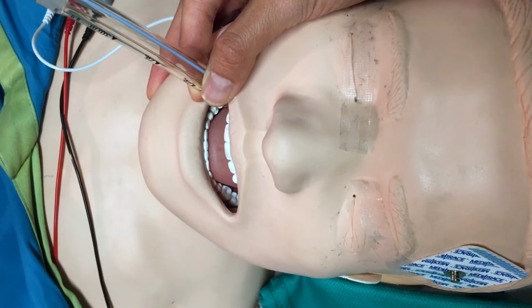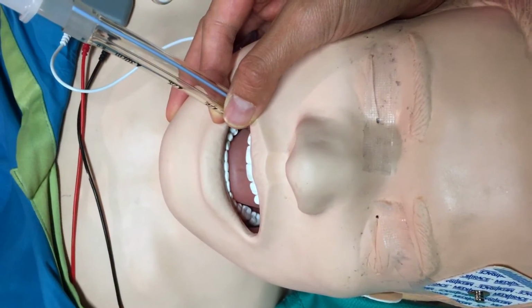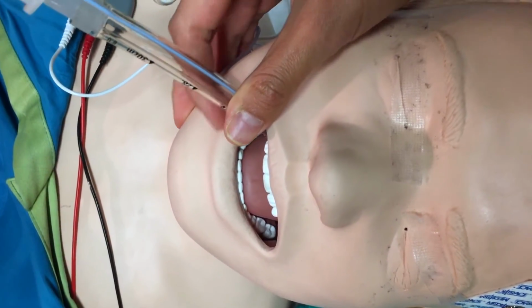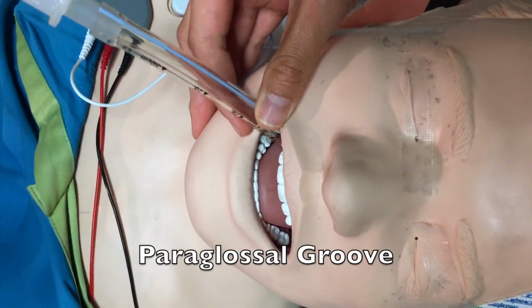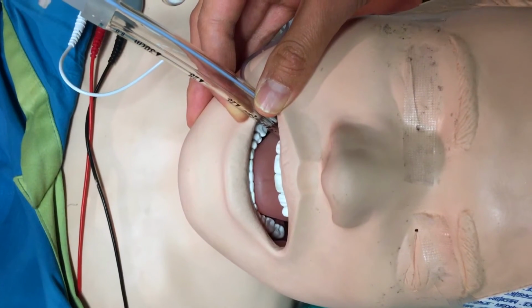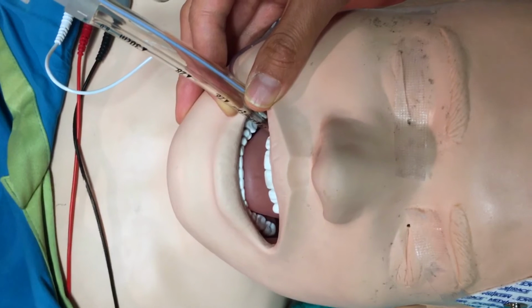To secure the ET tube, you want to make sure it's on the appropriate side, possibly the non-surgical side if possible. The ET tube will be secured between the molars and the lateral aspect of the tongue, so it'll be the paraglossal groove kind of around here. Make sure the soft tissues are free of pressure, and you want to make sure to tape it securely. Now I'll have a picture of what that looks like.